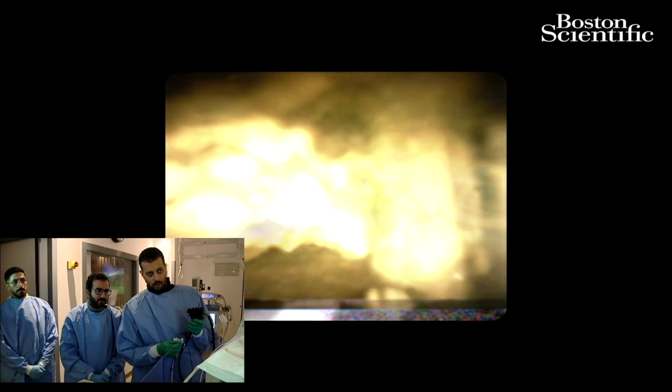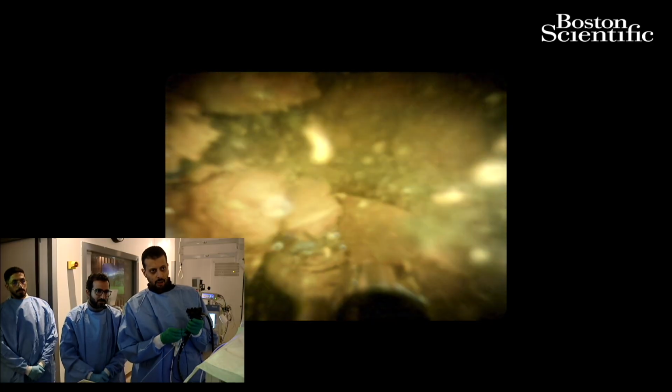So that's good. Yeah, good. So we'll push it out so it doesn't. One second. Good. Let me pull back the SPY.